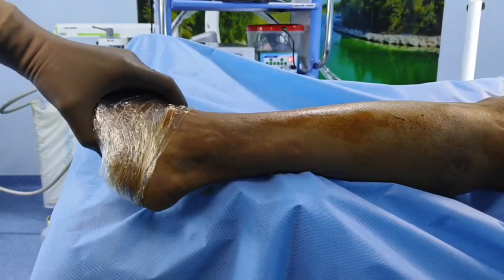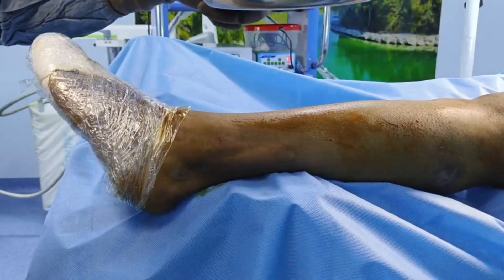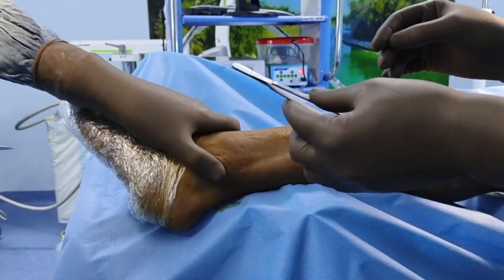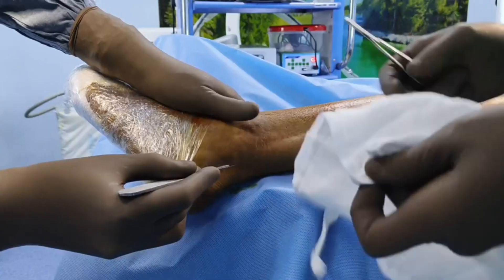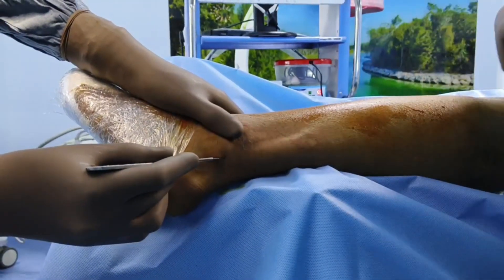Hello friends, myself Dr. Anurath Tiwari, and today I will be demonstrating through this video the harvest of peroneus longus graft. The peroneus longus tendon can be used for ligament reconstruction in the knee for ACL, PCL, or for tendo Achilles repair with augmentation of peroneus longus.